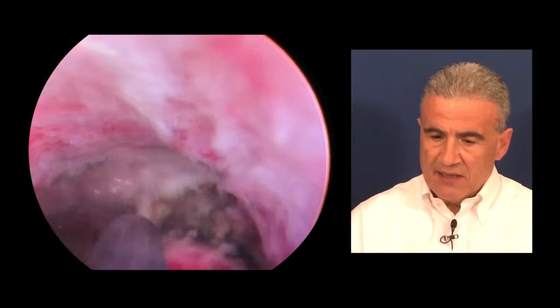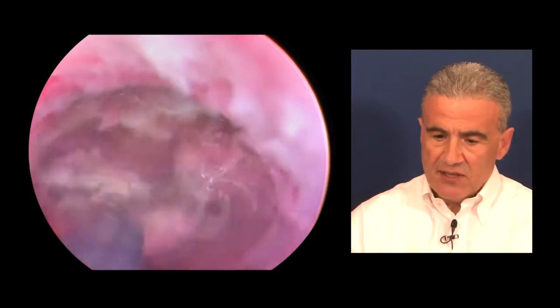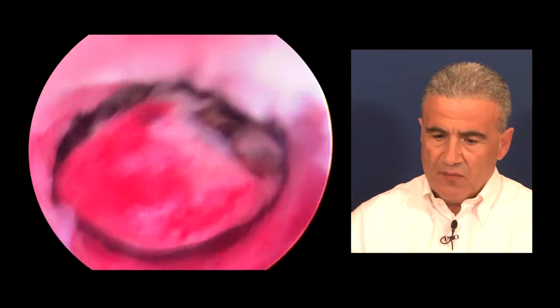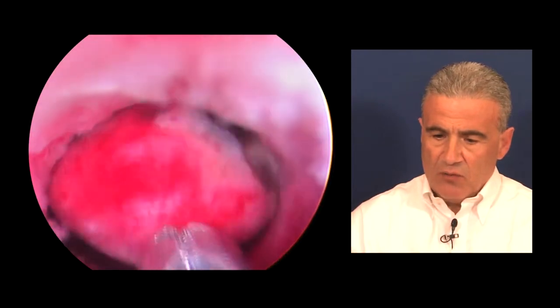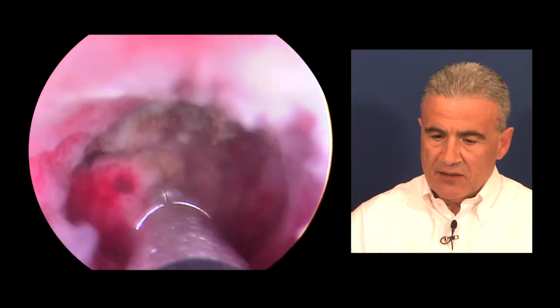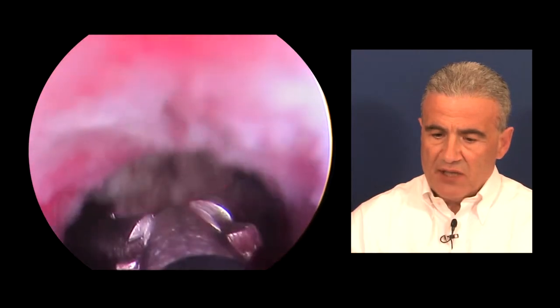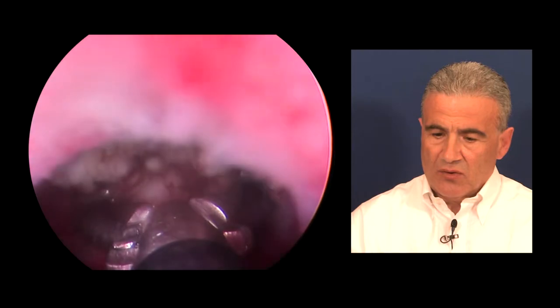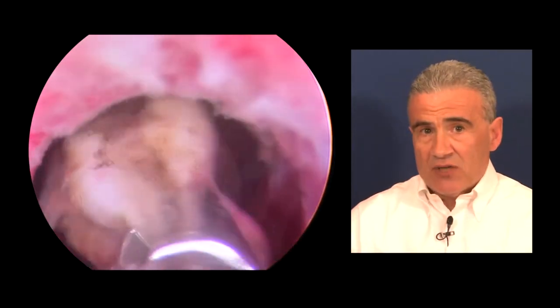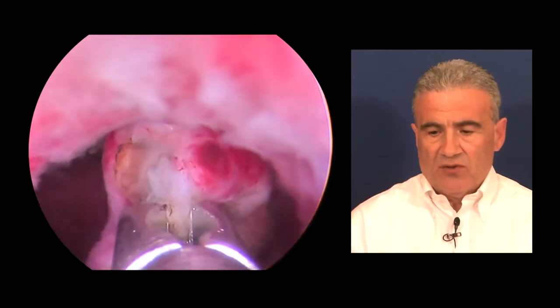The residual fibrous area in the insertion area. Now the polyp, which is completely detached, is caught with grasping forceps and with a twisting movement it is completely detached and then brought outside the cervical channel through the external sheath of the instrument.